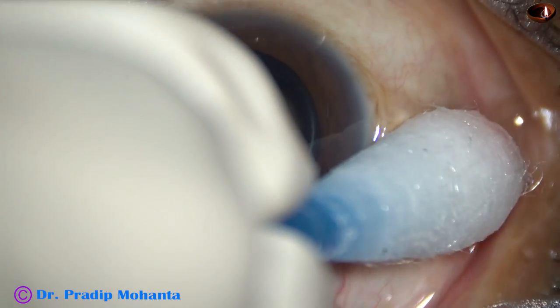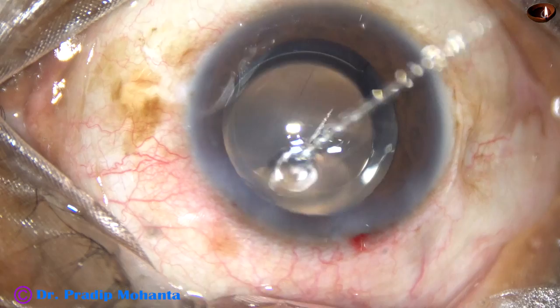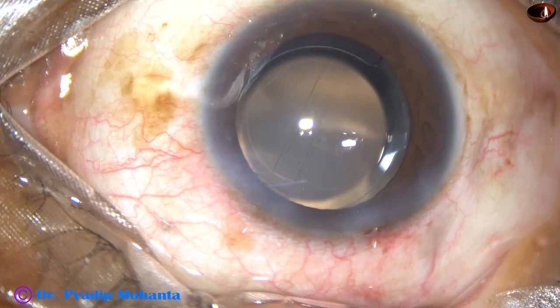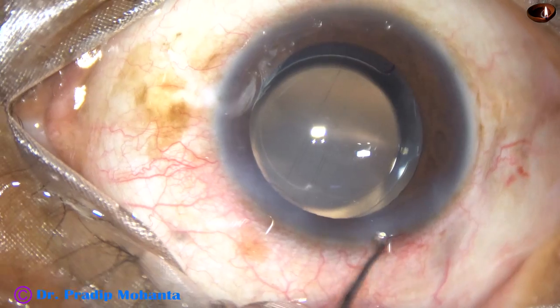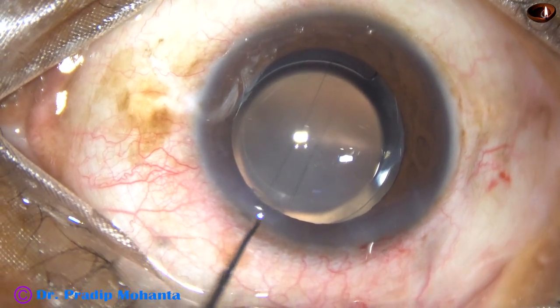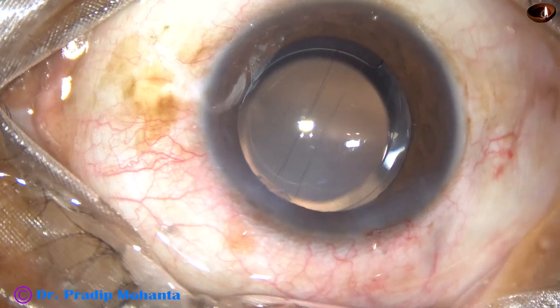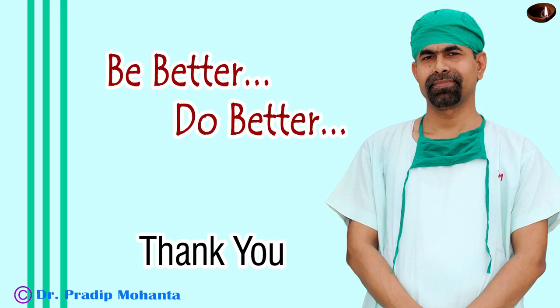Now I check the intraocular pressure and find that the eyeball is very hard. So I take a Sinskey hook, depress the posterior lip of the side port, and remove some BSS. The intraocular pressure then becomes normal.